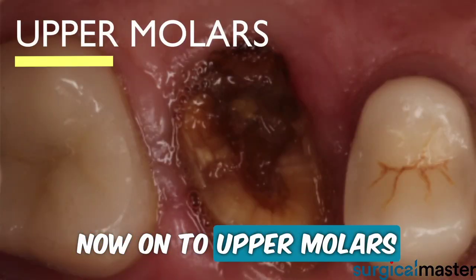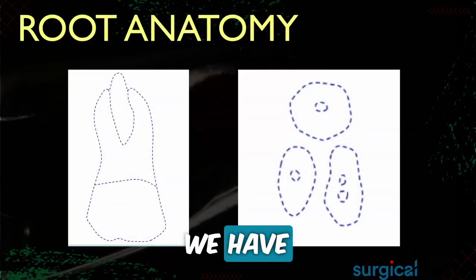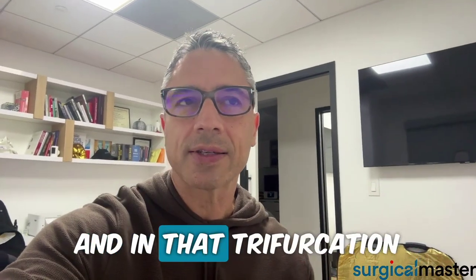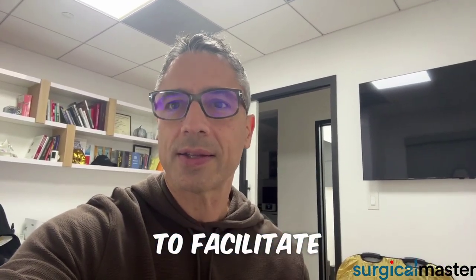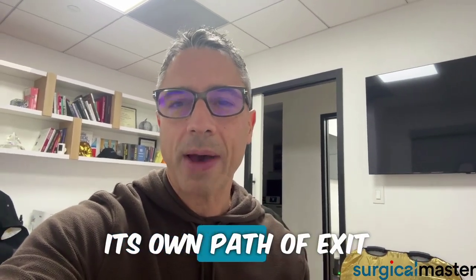Now onto upper molars. First, review the cross-section of the roots. We have two buccal roots and one palatal root. At the trifurcation, we're going to separate between the three roots to facilitate the extraction, because each root will have its own path of exit.